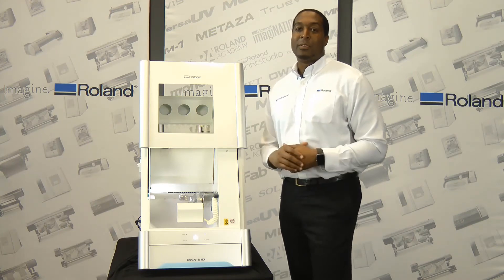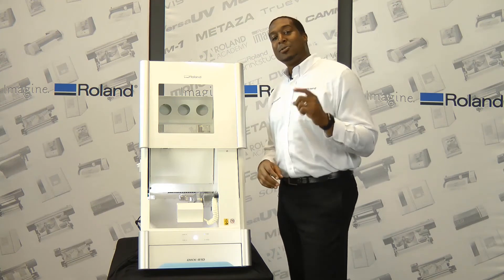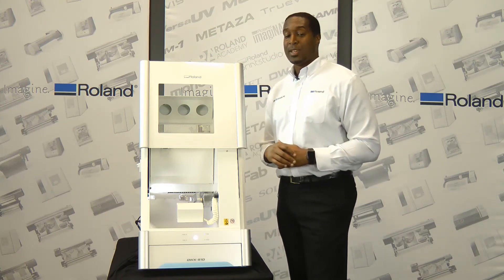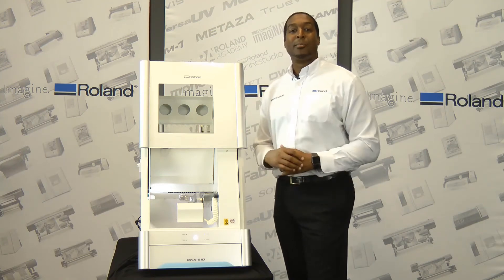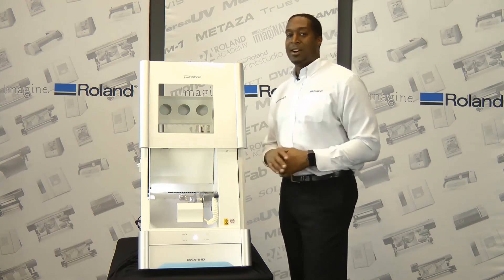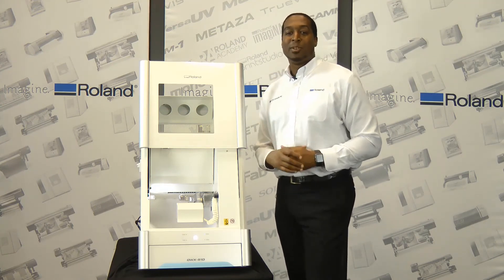The DWX51D is designed with a 20-degree bed that channels milling waste directly into the suction area for the vacuum. Compressed air will allow you to push all of your material waste right down into that internal bed.